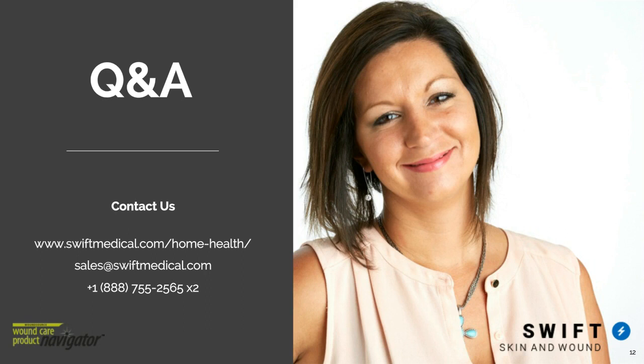How do you examine wound closure rates over time, and how do you manage a patient's risk of acquiring a new wound? So great question, 2 parts. Managing a patient's risk of acquiring a wound, we see prevention is key. How can we be proactive versus reactive? So by using our solution, we have a couple different ways with risk management for using Braden tools or Norton tools, as well as a total skin assessment. So capturing what's going on with the patient on admission within those first 24 hours. So you can see throughout your staff who's being compliant, as well as at the patient level, who's highest risk, and ensuring that those interventions are in place.